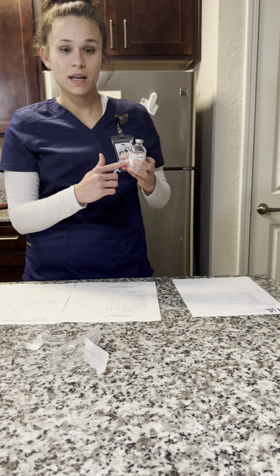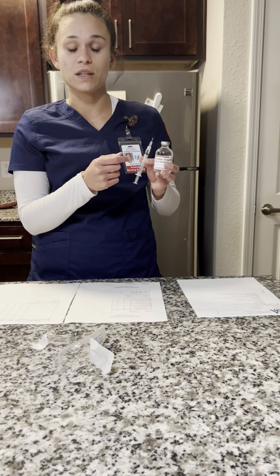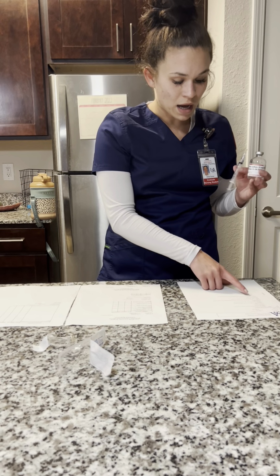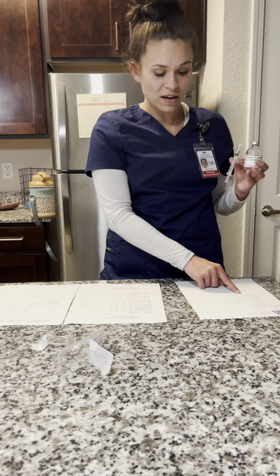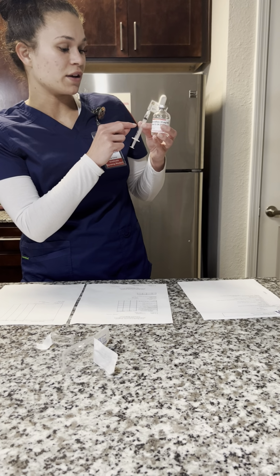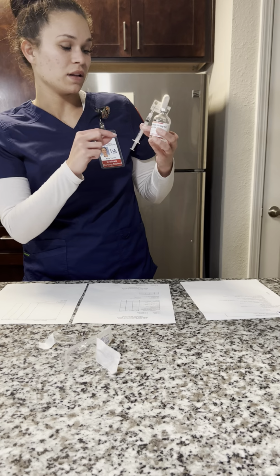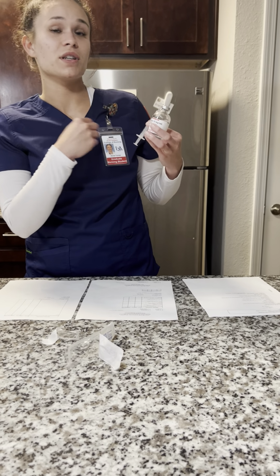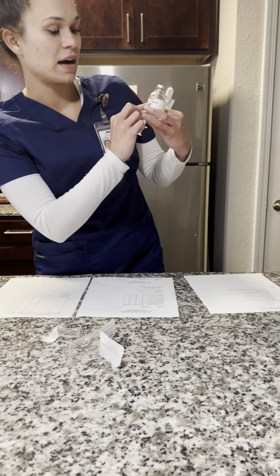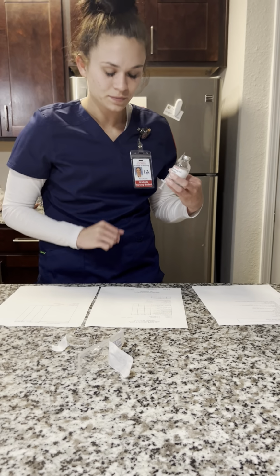I have morphine sulfate here. The MAR also says morphine sulfate, and I put morphine sulfate into the syringe. Okay, the right dose, which is 5 milligrams. I have half of a milliliter of the morphine sulfate, which is equal to 5 milligrams because the vial says 10 milligrams per 1 milliliter, so half would be 5.